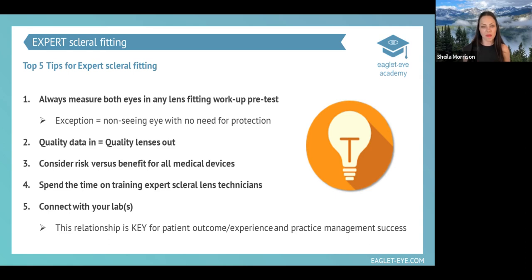Number 1, I've had many times, or enough times, that we spend a full office visit evaluating a patient for a referral for one eye only. And then somewhere down the road, they end up wanting a device on the other eye. Perfect example is mild, maybe moderate keratoconus, satisfied with a soft lens, and an advanced case on the other eye, fit that first eye, love the comfort and the vision in the scleral.